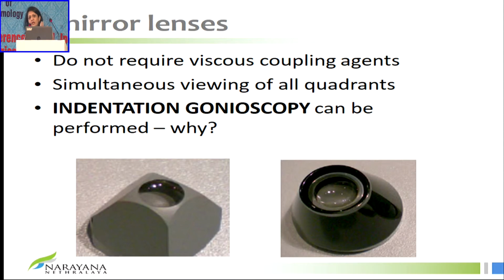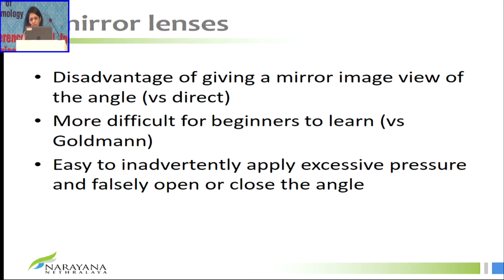If it is closed by synechial closure, then it does not open the angle, which helps us differentiate between an appositionally closed angle versus a synechial or permanent closure. This is useful for us in the management of the patient, so it is very, very critical for us to use these instruments for the management of glaucoma.